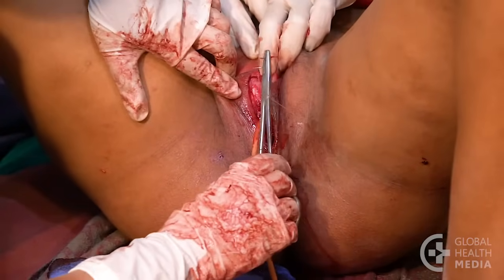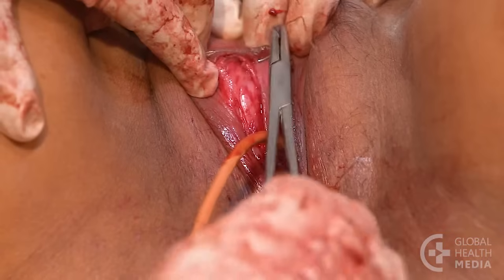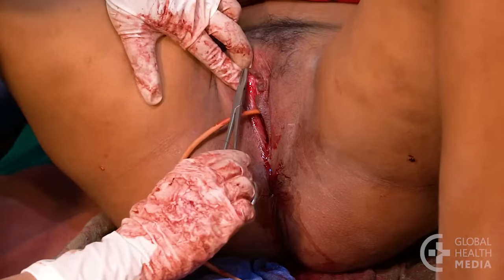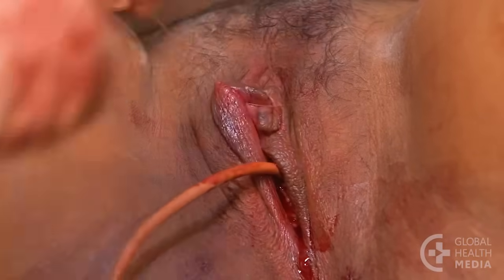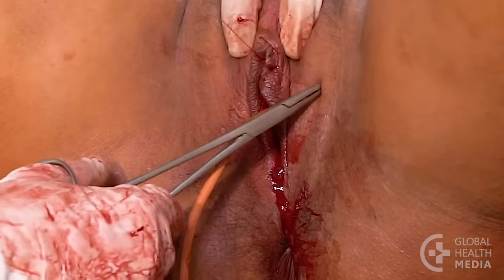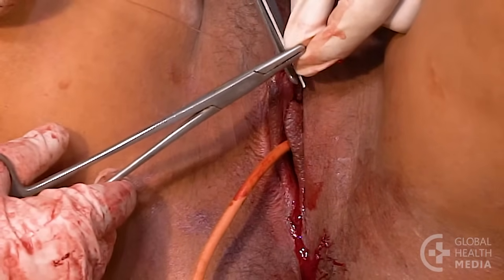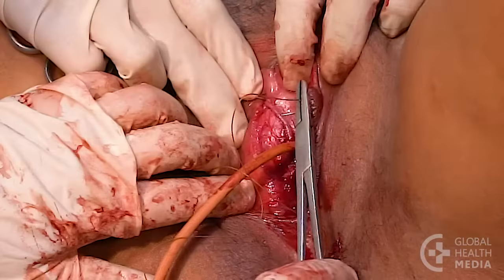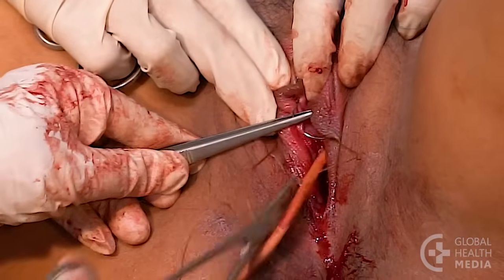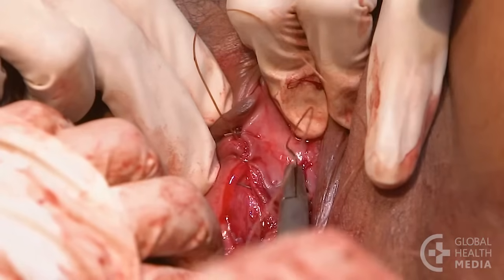Now repair each tear. Start at the top of the tear with an anchor stitch. Take a shallow bite and include a little of the underlying tissue as you bring the edges together. Then make a four layer knot. As your helper holds the tissue open, continue with a running stitch. Be aware the tissue is delicate and there are nerves in the area. Take shallow bites to unite the edges and again include a little of the underlying tissue.